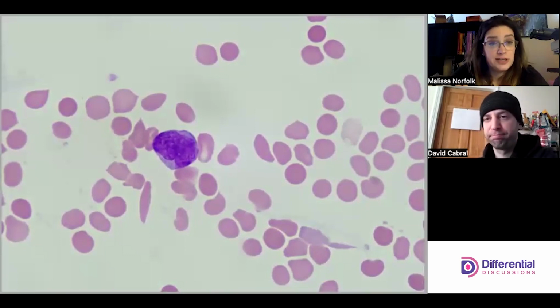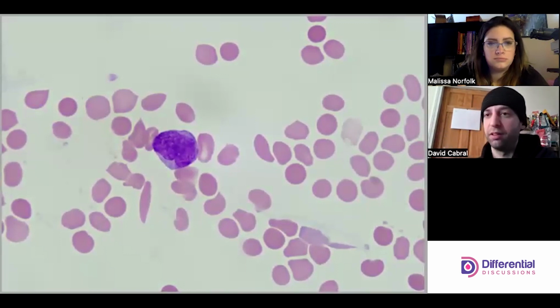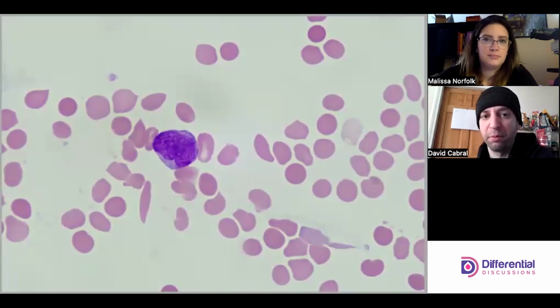And then flow cytometry and cytogenetics follow. I think we do get hung up on guessing what the lineage might be, but to some extent that's beyond the call, so to speak. If you have relevant clinical information that you can see morphologically, let's report it. But sometimes you just get what you get, and it's good enough that you discover that it's a leukemia.